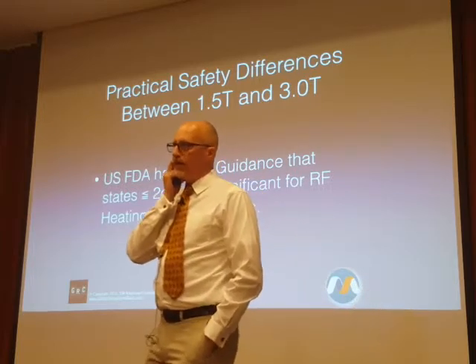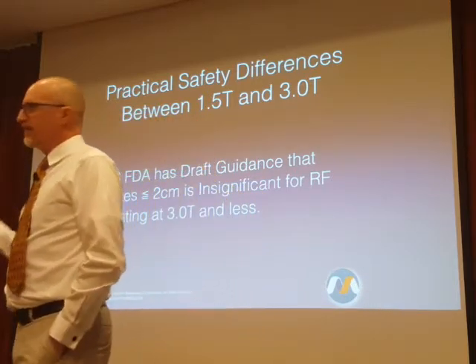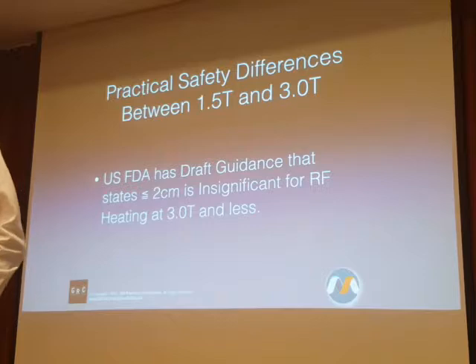The US FDA right now has a draft guidance document out for MR conditional implant device testing.